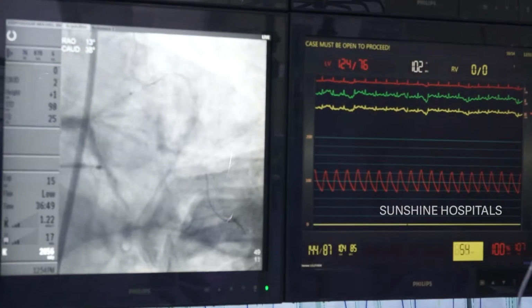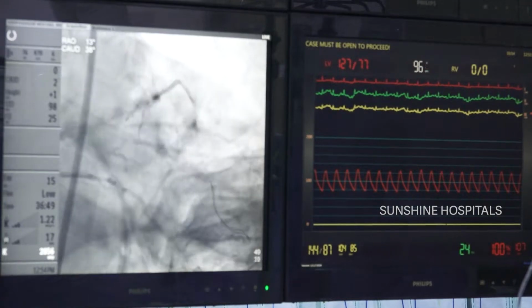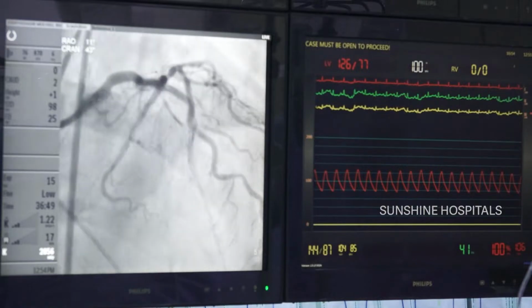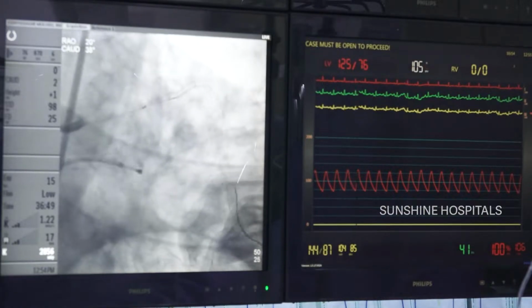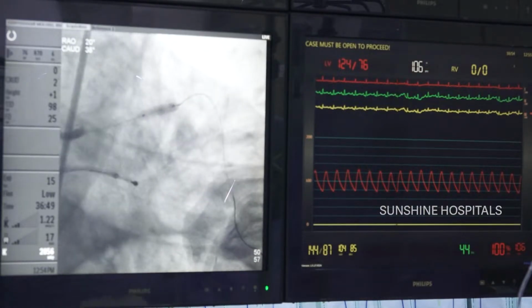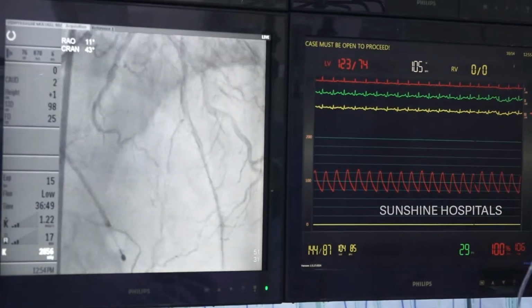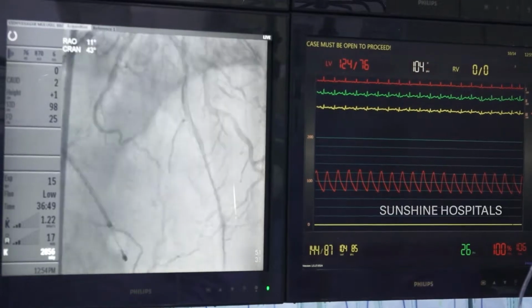You see there is a tough lesion even after open NC. Pull back. Then you can see up to ostial LAD, then we dilated with open NC balloon. Went up to 40 atmosphere inflations. Even ostial LAD was dilated.